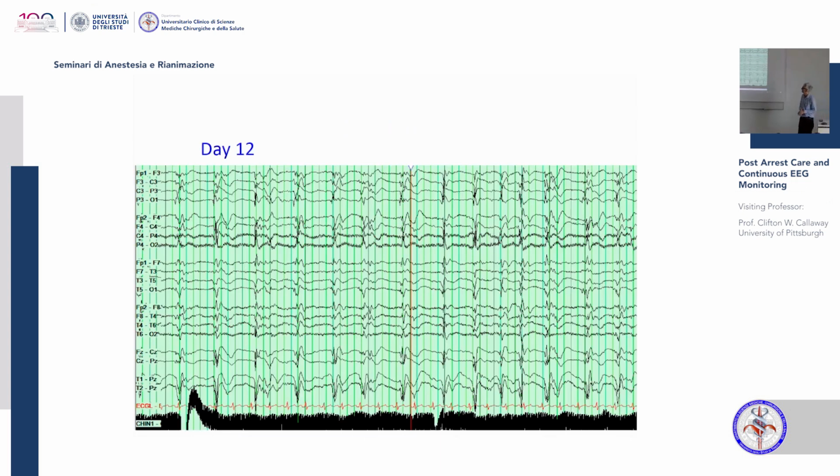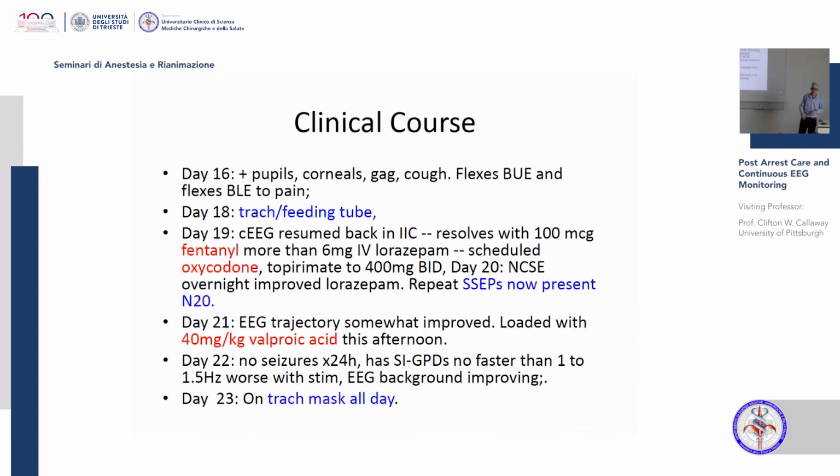And, you know, here's day 12, still lots of epileptiform discharges. That looks like EKG, yeah? That's why they put the EKG lead on your tracing, so you can be sure that it's not accidentally picking up EKG in your brain. If you can see the EKG on your brain, that's a sign of very large suppression. If this is EEG and it's... or brain dead, yeah, it's bad.